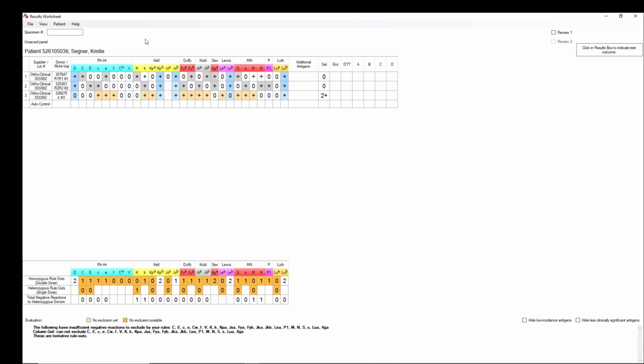Okay. So when a new patient comes in, you're going to enter those few lines. You're required to put in a number and a name. I think date of birth is optional, but a number and a name, and then it'll be added to your list. You can add them anytime. You don't have to add them when you're working. If a patient comes in, you can bring up a screen and select the patient, put in all the information for the patient, and then not save your work, but the patient will still be there.